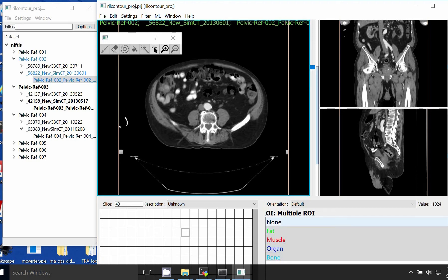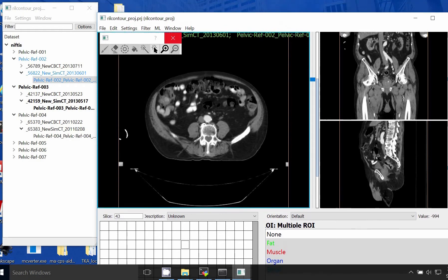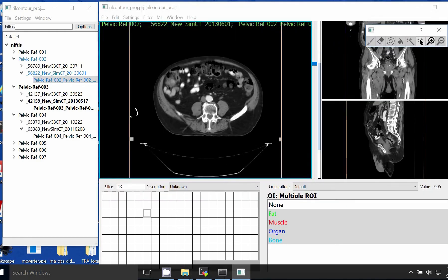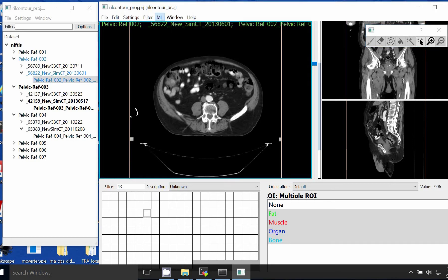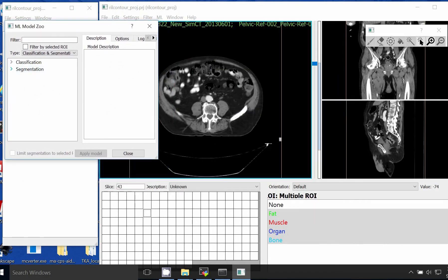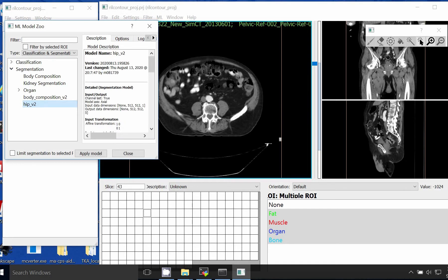The first thing we want to do is apply our automated segmentation algorithm. I already have the model loaded, so we'll go up to ML for machine learning, then Apply Model. This brings up our model zoo. There are a few models here — we're going to use hip v2. The nice thing about the RealContour interface is that you can apply the segmentation model on many slices at once. Down here in our slice selector we'll select the slices we want.